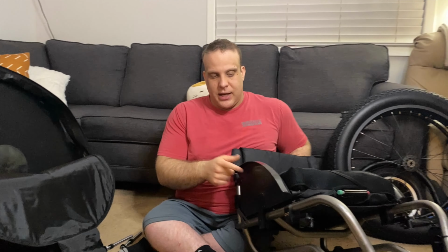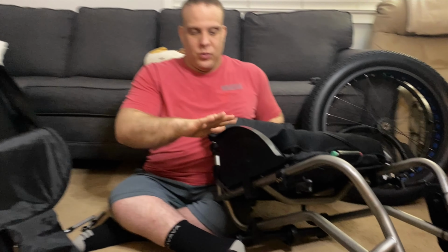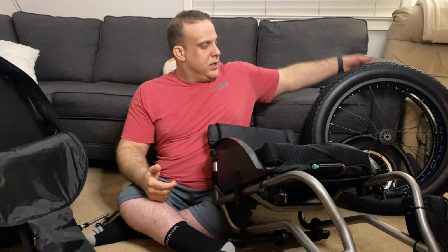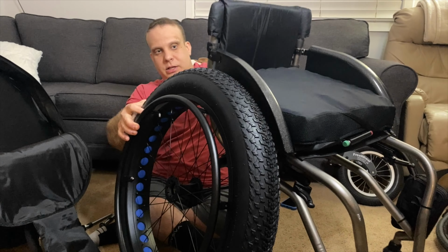All right, so we got my everyday wheels off the chair, and you can see the side guards that I have on this chair are the ones with the wheel well kind of flange thing here. So that, as you can imagine, might create a little bit of a problem, because when we try to put these tires on, we're gonna have some clearance issues.